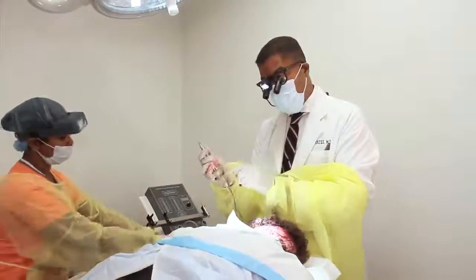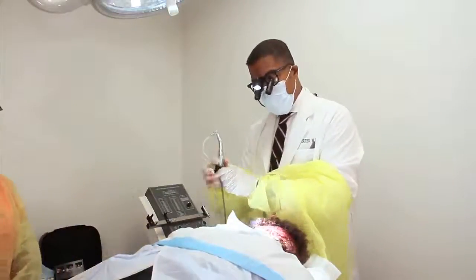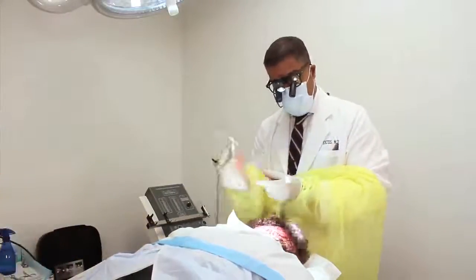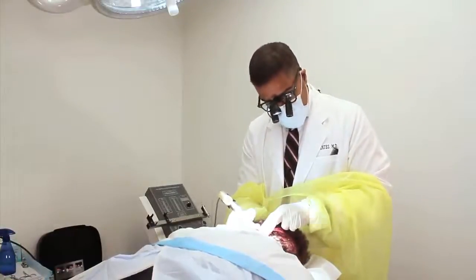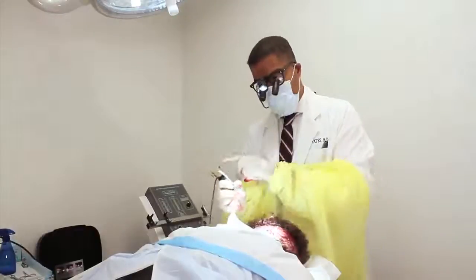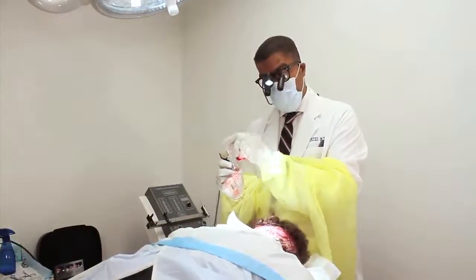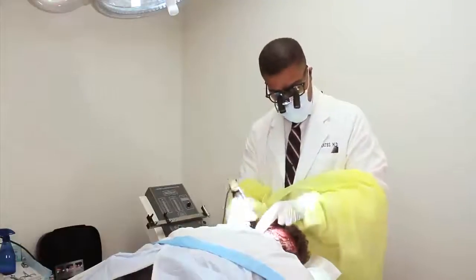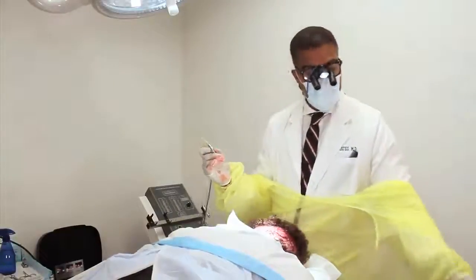You can suck the grafts into this receptacle here. It's a motorized sharp punch that looks like a dental drill — you hold it like so, and you punch grafts and drag them into the suction device. You don't have to use the suction device; you can remove it and just boom, go about your business and then retrieve the grafts.